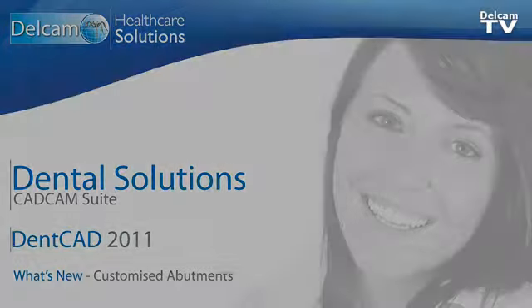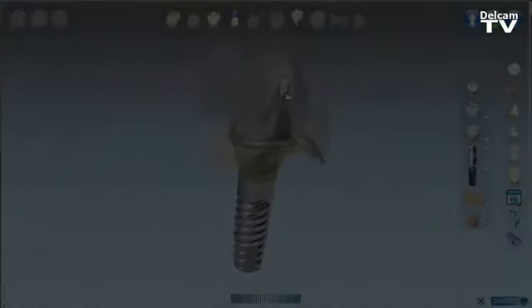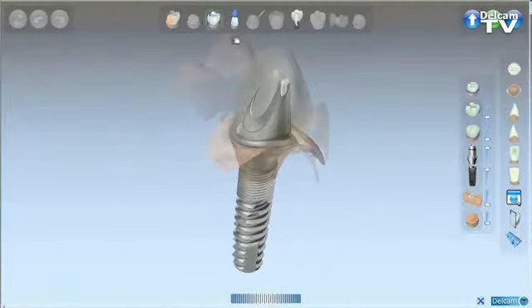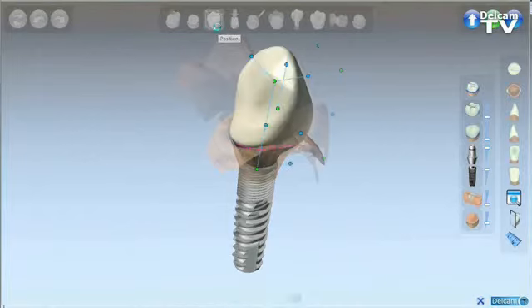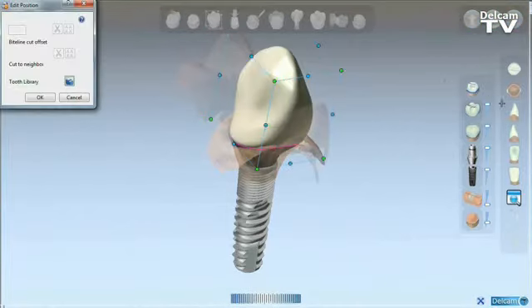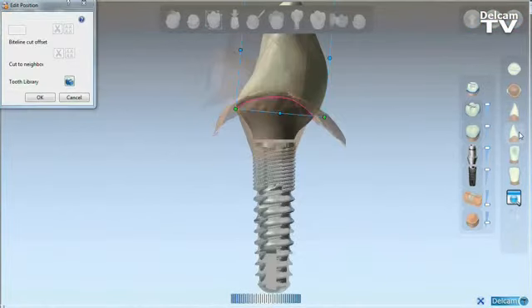DentCAD 2011 New Features. The new edition of custom abutments.